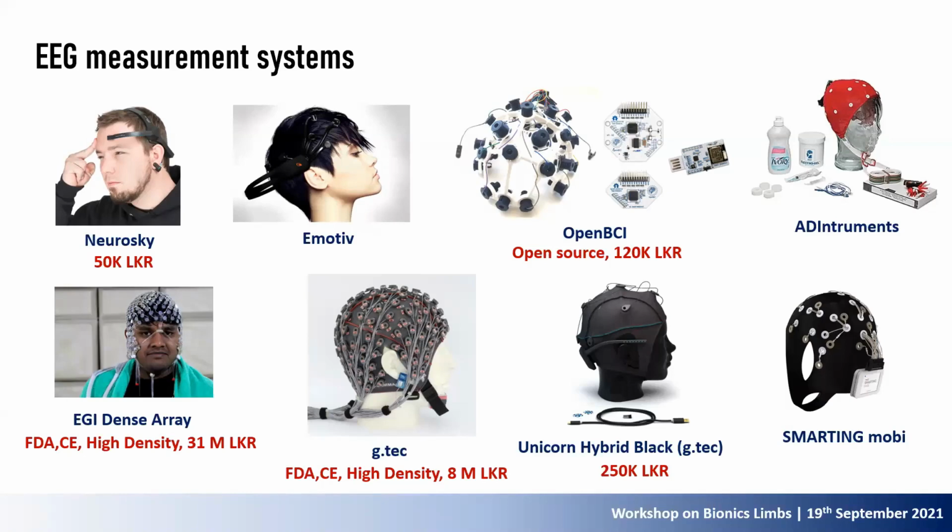And then recently, g.tec has introduced another cost-effective system called Unicorn Black, which is a pretty good system because it has a wireless connection, so that you can easily use it for research and other, or even hobby, activities.